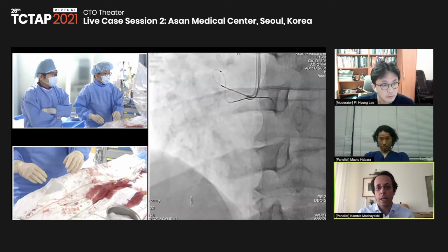Actually, we know the Boston IVUS is compatible with a Caravel, a low profile microcatheter, or you take a Medtronic guide, which in 7 French has a bigger inner lumen than the Cordis guide, which would also work with a Philips and the Caravel, or low profile microcatheter. But here, probably in case of backup and everything, 8 French would also be reasonable for me.